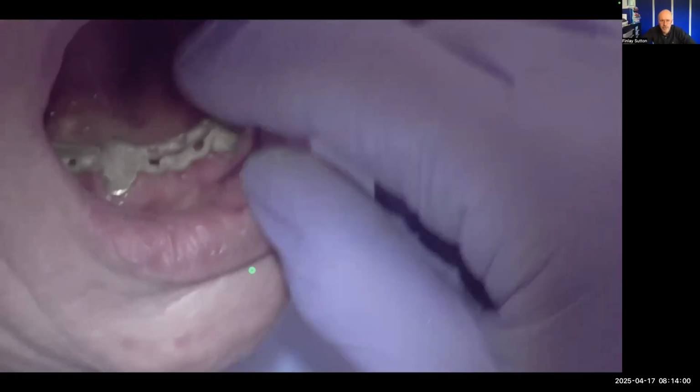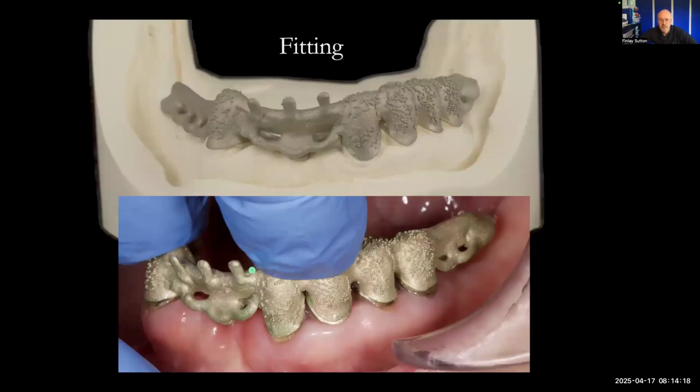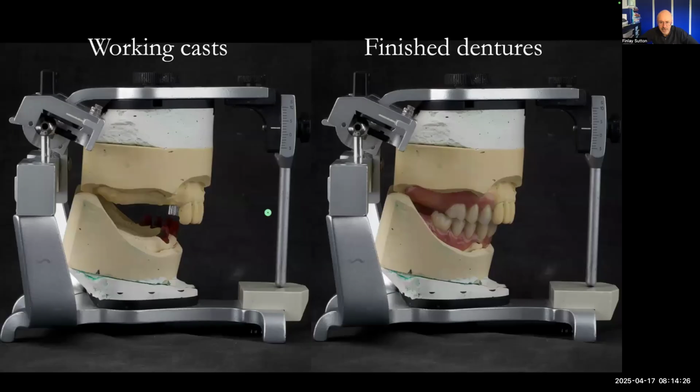Do you know what I really wished I'd have done though? I really wish that I'd just not bothered doing that and finished it and just let those copings, the teeth, just settle in, because I think the fit would have been better looking back. So anyway, that's it there. We got it fitting. And then we'll just go now to finish. So Rowan finishes everything.